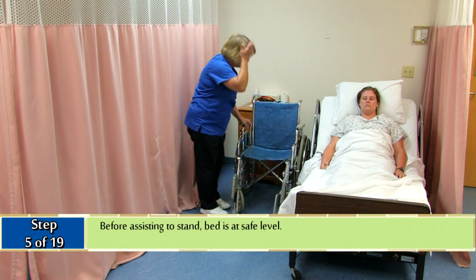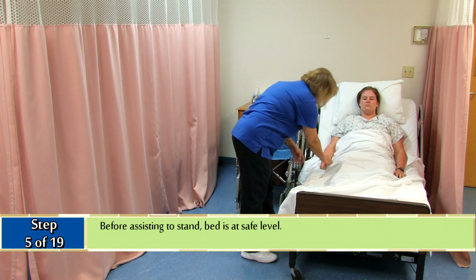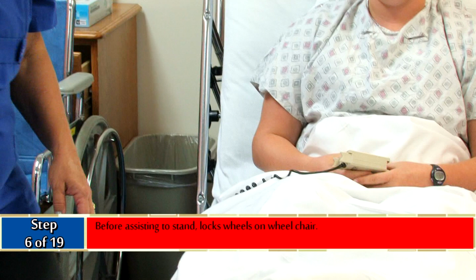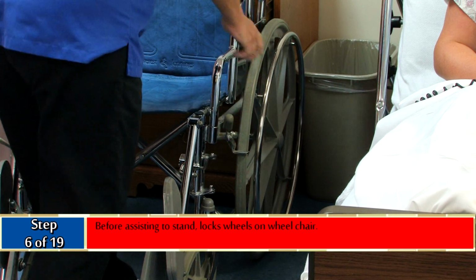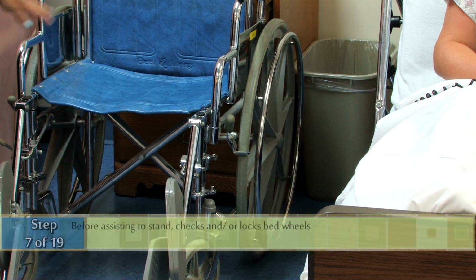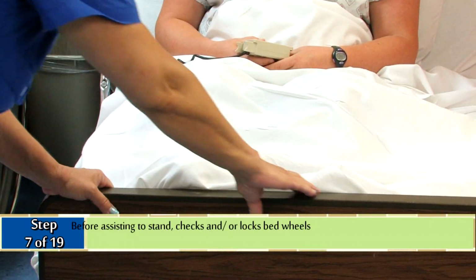Before assisting to stand, the bed is at a safe level. Before assisting to stand, critical element step 6, locks wheels on wheelchair. Step 7, before assisting to stand, checks and/or locks the bed wheels.